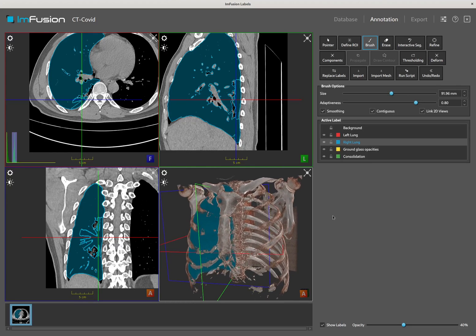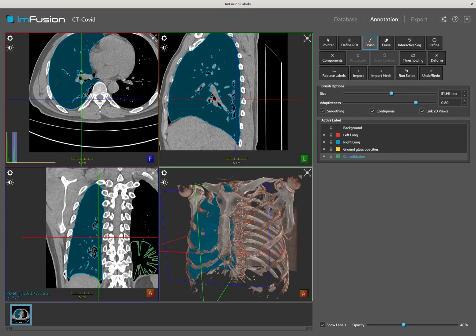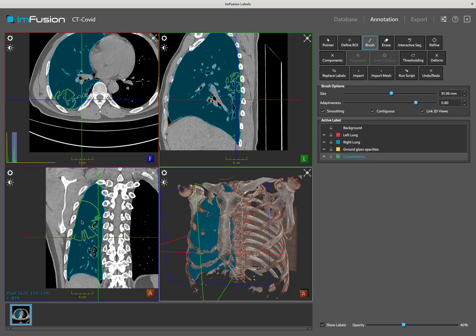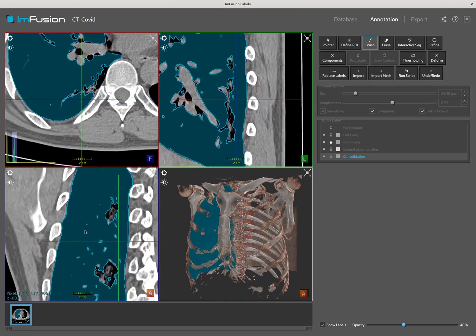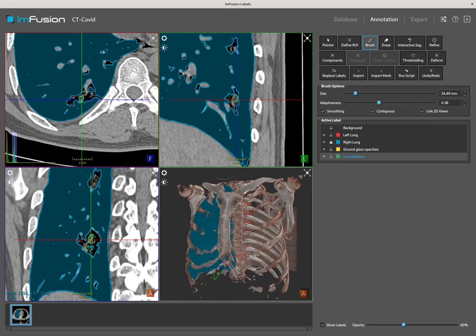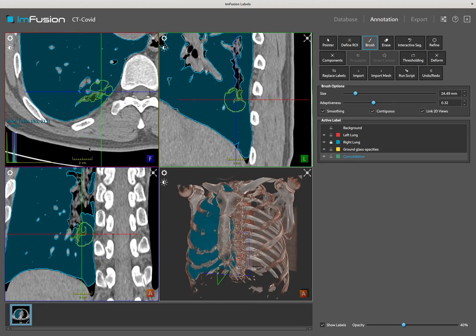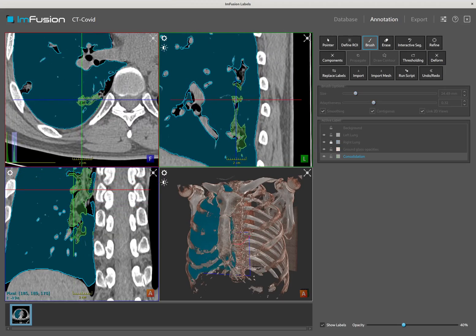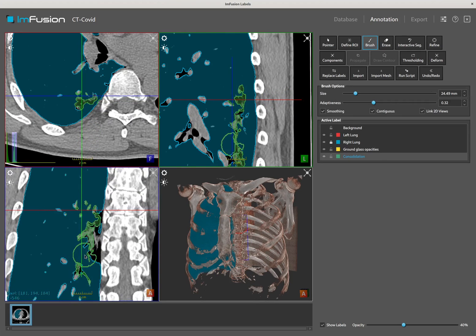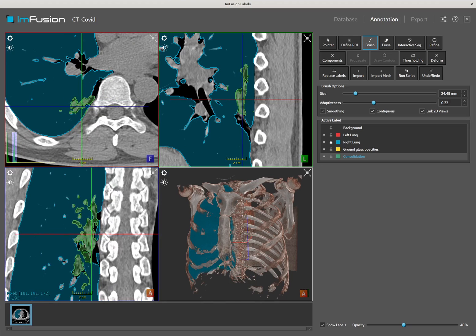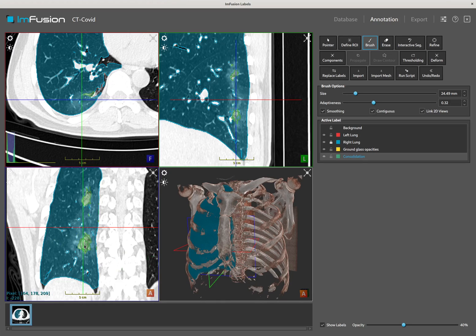Now that the lung has been segmented, I can move on to the infectious part. Note that this demonstration does not aim to be medically accurate and instead should serve as a feature showcase. I will continue segmenting the consolidation. Since the consolidation is small and with higher intensity variants, I will use a lower radius and a lower adaptiveness. In addition, since I do not want to overwrite the already segmented lung part, I can lock it. Locking ensures that an already painted area will not be overwritten. Once I am satisfied with the segmentation of the consolidation, I can lock it as well to make sure I do not accidentally override it.